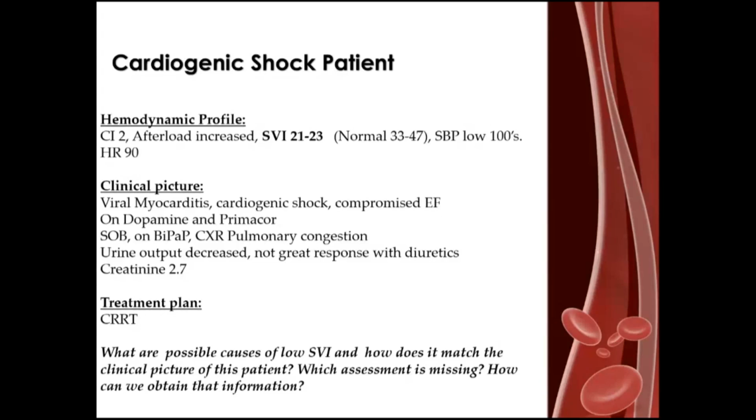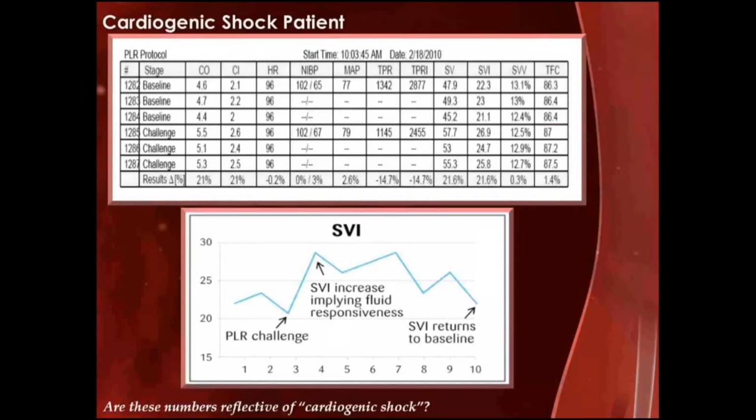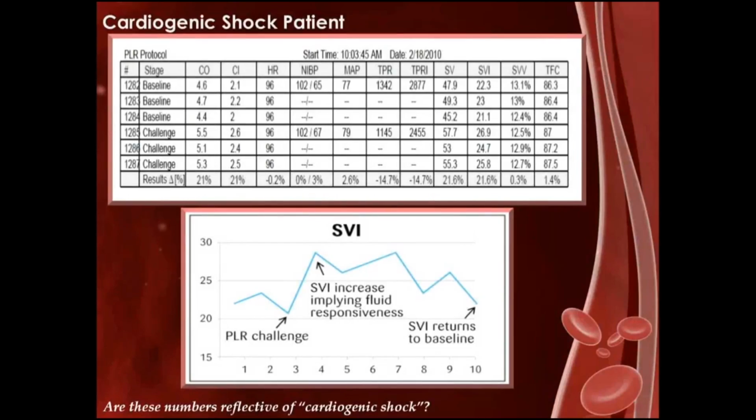So I went in there and started assessing him, and I did a passive leg raise on him. He actually increased his stroke volume index by 21.6%. So this guy was actually fluid responsive. Now I went back to my pulmonologist and explained to him what I saw.